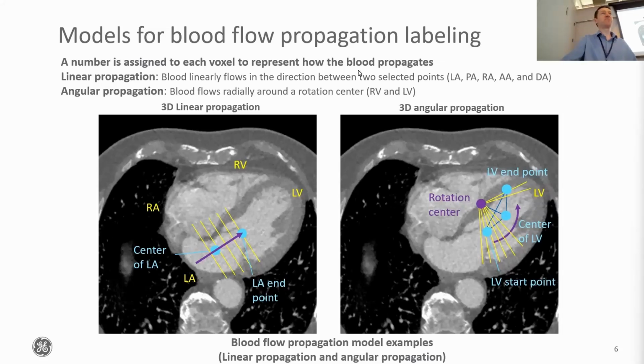Okay, so what we had on the last couple slides, I'll just describe, and maybe it'll wake up here. I had some difference images between the projections that we generated with the real projections as well as the simulated projections at different phases, showing the difference between a baseline phase and other cardiac phases. And you can see very good visual similarity between the simulated images and the true original images.